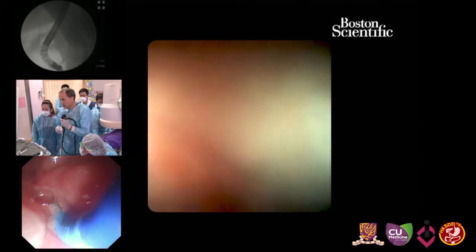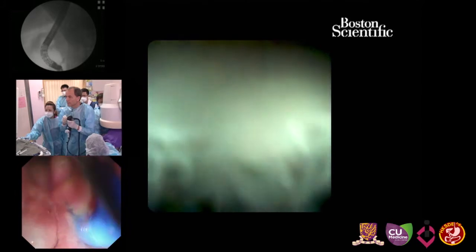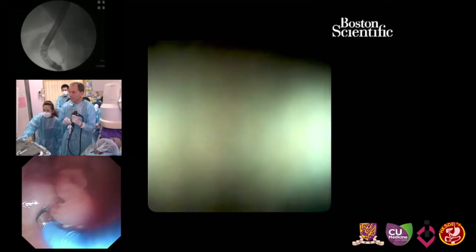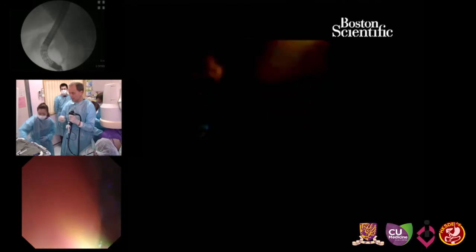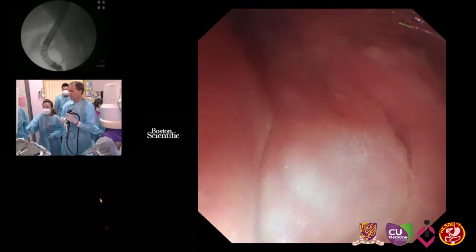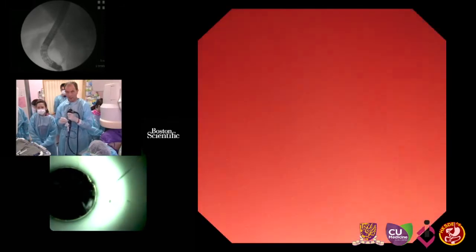Let me see. Flush again. No, the patient is moving again. But I think we already achieved, no, the patient is moving, I'm out of the duct now again. But I think we should be able to remove the stones now with baskets or balloons. So I think we could nicely see that we can visualize the pancreatic duct very nicely and could fragment the stone. But in the interest of the patient, it may be better to stop, or we can discuss trying to remove the fragments, because it's very difficult to proceed with sedation here.